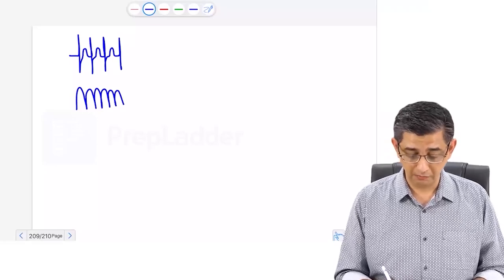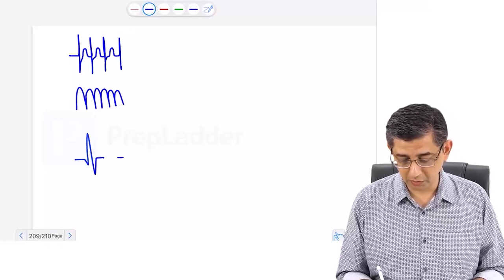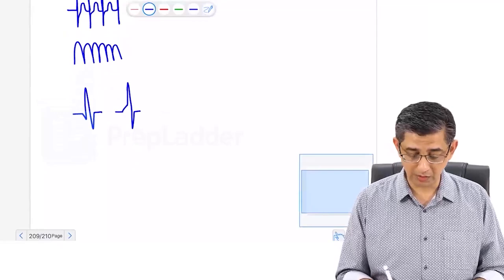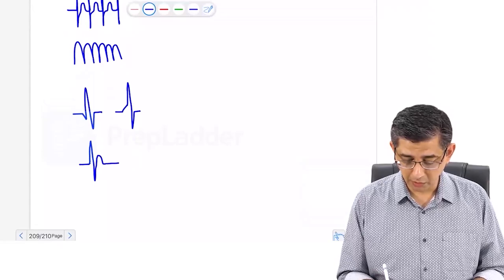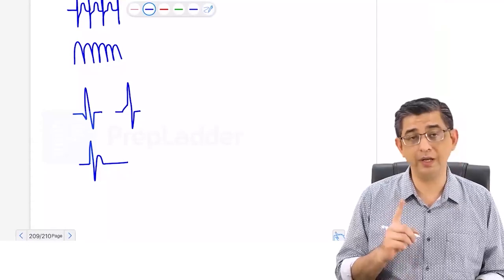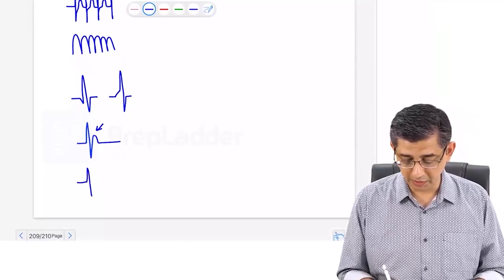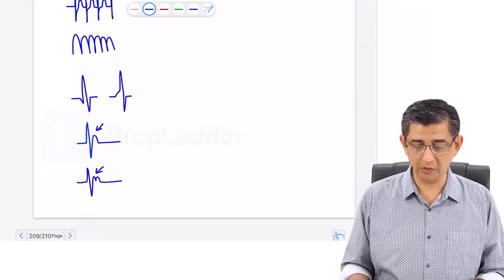In fact, whenever we talk about QRS complex, you always have to watch out for change in the slope in the upswing of the R wave, that is a delta. You have to also contrast this with what I draw next as J wave / Osborn wave. You see, I have already explained to you that the end of the S is what is technically called the J point or the isoelectric point. But now I have drawn a J wave, and lastly I am highlighting at the same area but rather in a different way, a wave that is called epsilon wave.